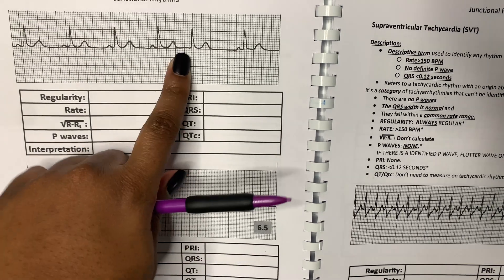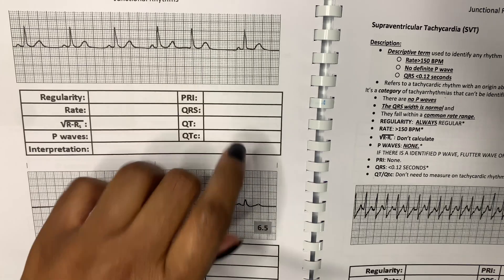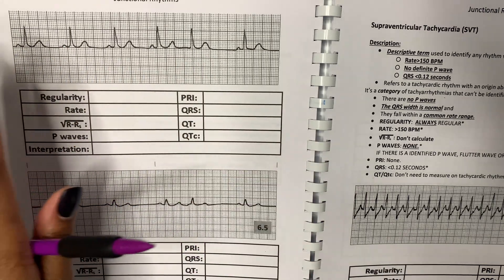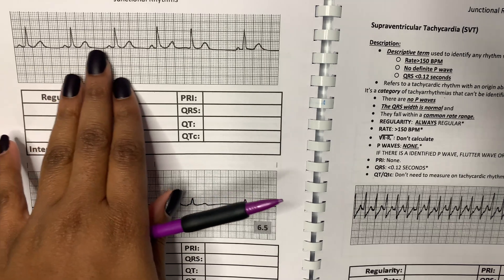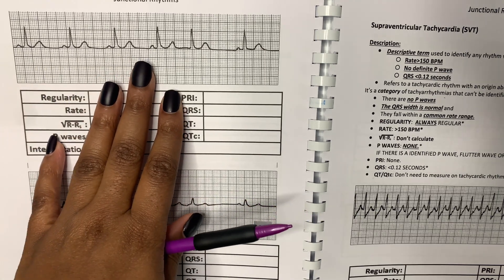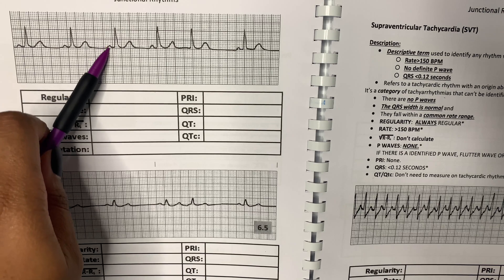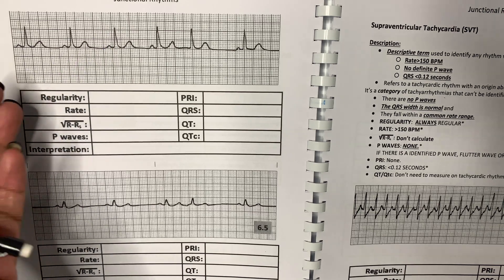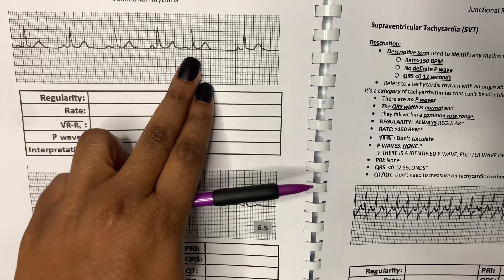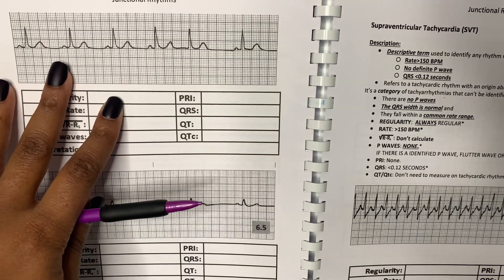So if you look at this PJC, first things first, always identify the underlying rhythm. You can see this underlying rhythm is definitely regular. Just without measuring, I can see that it has one P wave, it's upright, it's one and one in the same. So obviously this is a sinus rhythm, but this PJC is disrupting the normal rhythm.